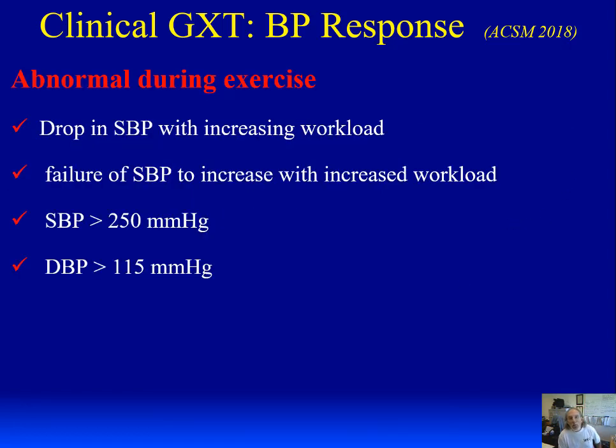Now, what's an abnormal blood pressure response? If you get a drop in systolic blood pressure with increasing workload, huge problem. And that's why it's so important that you can measure an accurate blood pressure. So during rest, that's fairly easy. During exercise, particularly on a treadmill, you'll learn the skill. I see students stress every year. Don't panic, you will learn it.